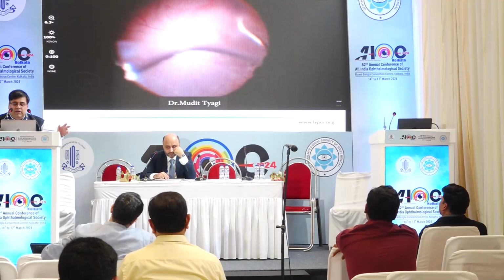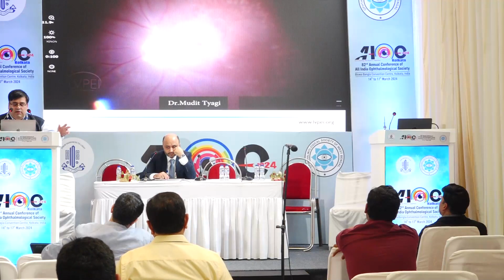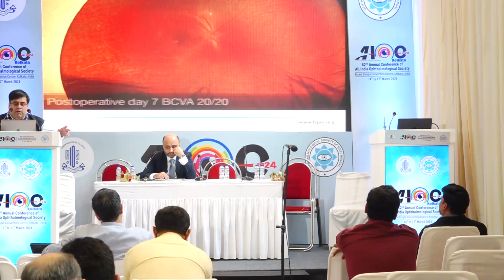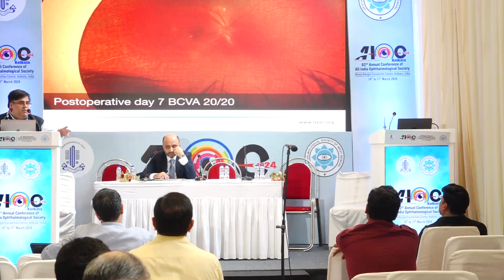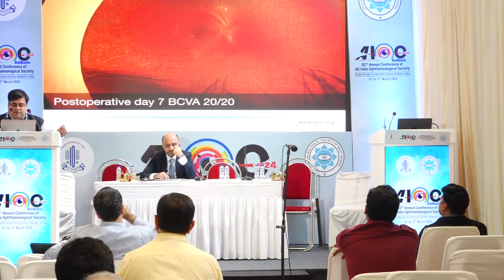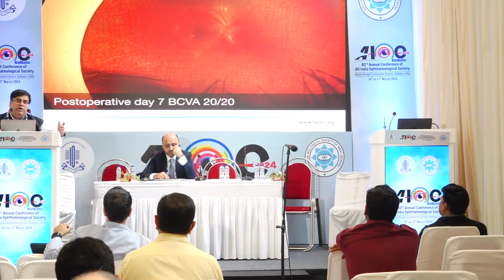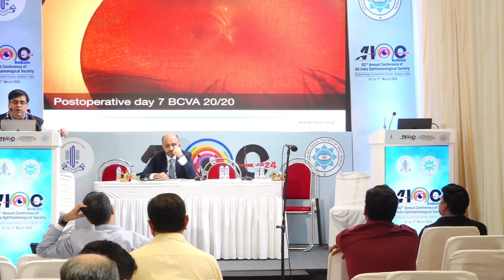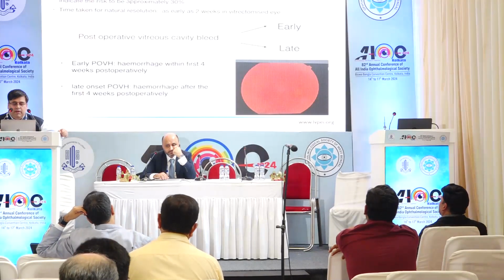This case was left on air. I'll show you the day 1 post-op. That's the glue coagulum on the disc, and that's day 7, the glue is absorbed. And you are able to avoid that messy first day, no view kind of a fundus. So there's another technique which you can try doing if your maneuvers of controlling disc bleeds are not working.